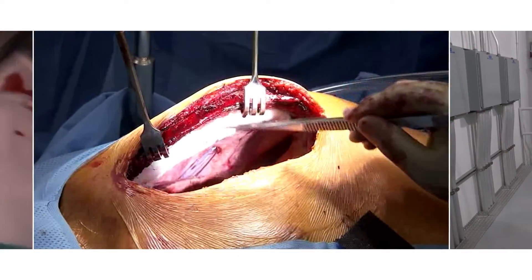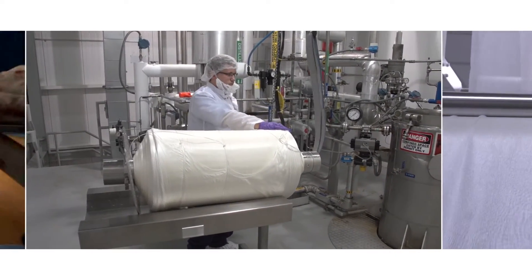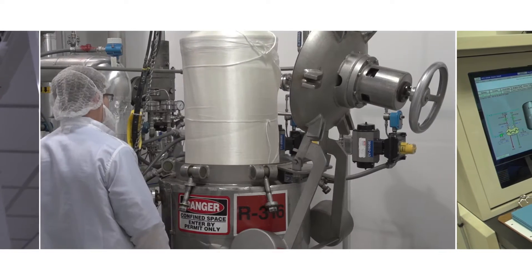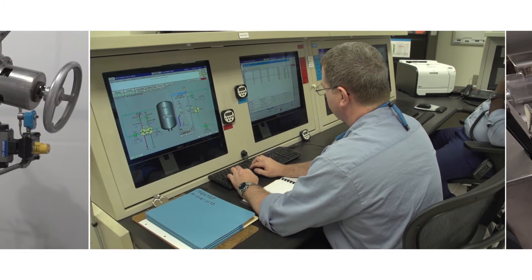Exceptional product quality stems from highly controlled manufacturing and precise oxidation. Our process is unsurpassed from a quality perspective, from our ability to oxidize to the right number. It's going to absorb the same way every time. It's going to be hemostatic. It's going to give you back to your acidic property. So it's really that process that controls the chemistry.